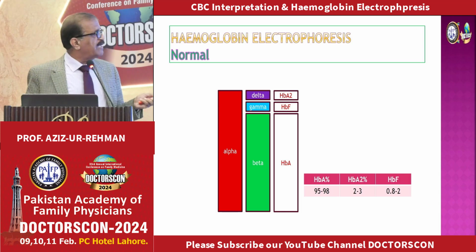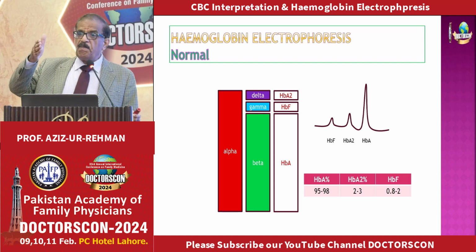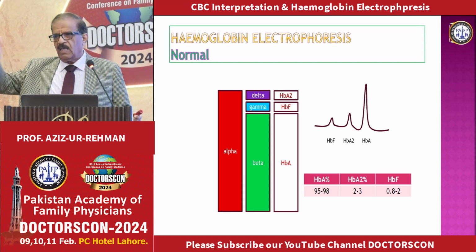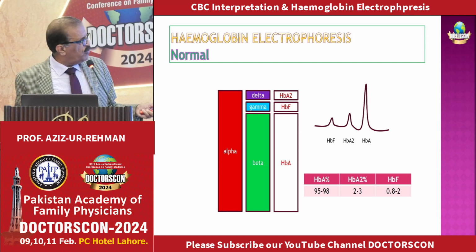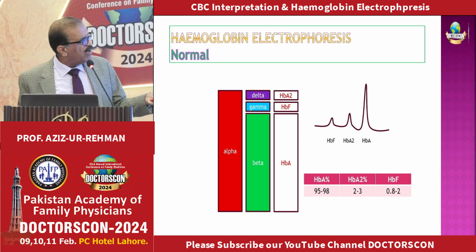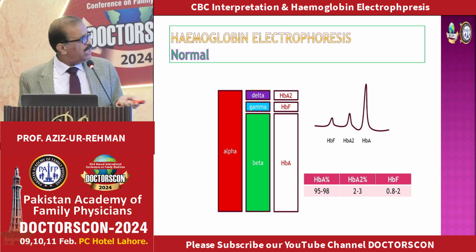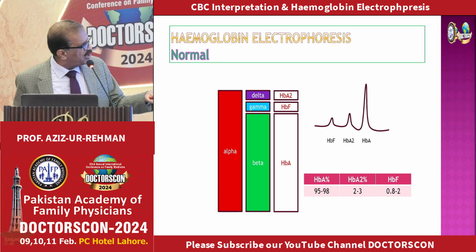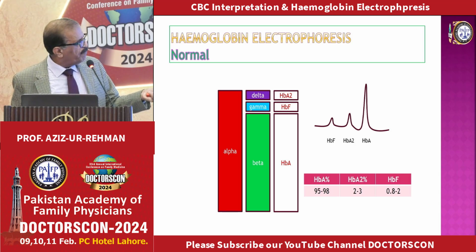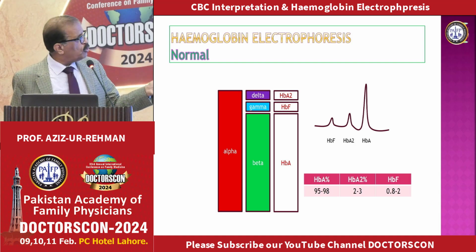This is detected by a test called hemoglobin electrophoresis. These 3 hemoglobins have different patterns of movement on the electrophoretic strip. So first we have HbF, and then we have HbA2, and then we have HbA. So this is the pattern which we see normally. Their heights represent their normal concentration. Okay, so this you must be used to. Many laboratories report these numbers as percentage of hemoglobin A, hemoglobin A2, and hemoglobin F, and many also show this graph. So this is the normal. Please print this in your mind.